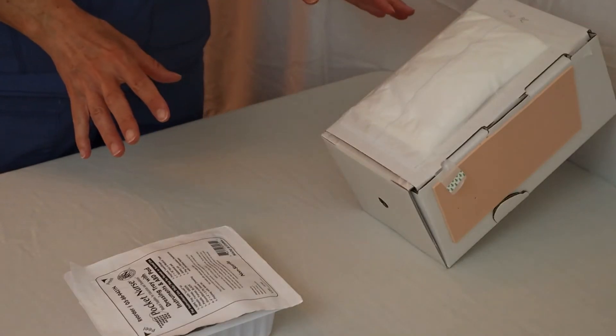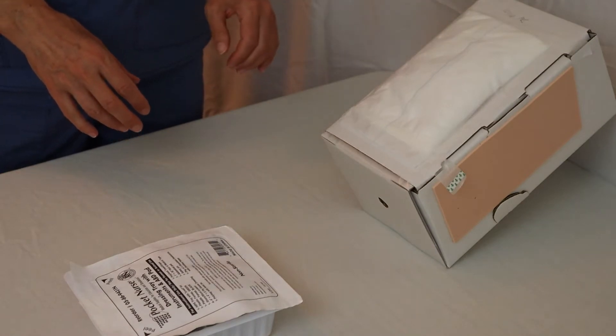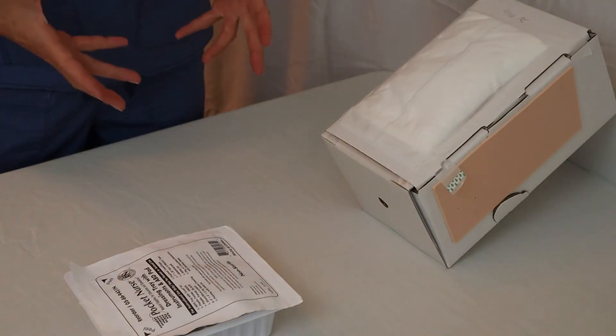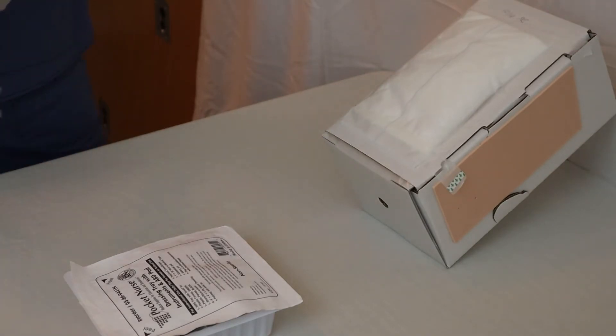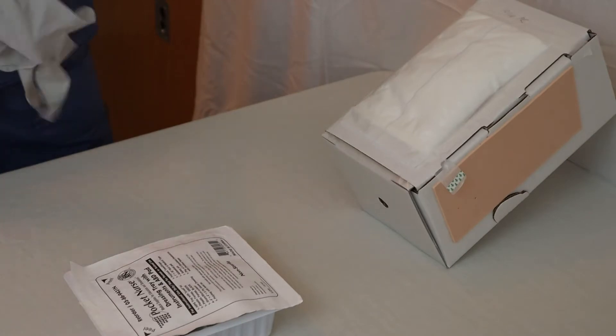Once I uncover the patient and their dressing, I can basically get ready to set up my sterile field and assess the wound. I will do this by performing hand hygiene and then putting on just clean gloves and removing the patient's dressing. Before I want to do that, I note here that this patient has paper tape.